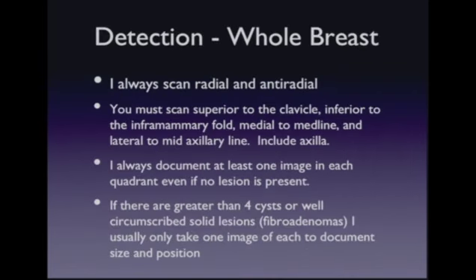I always perform scans in two planes, and I prefer the radial and anti-radial, but you can do sagittal and transverse if you prefer.